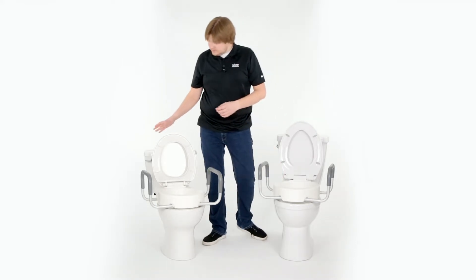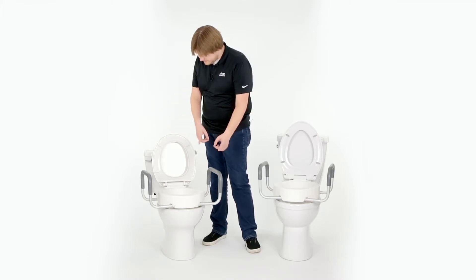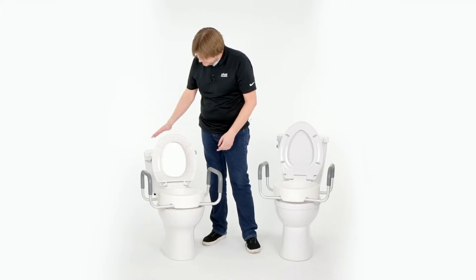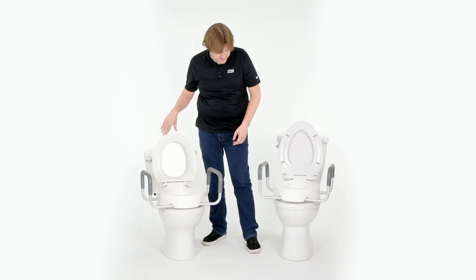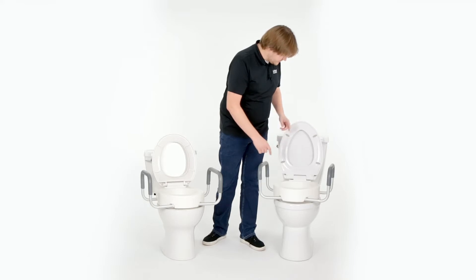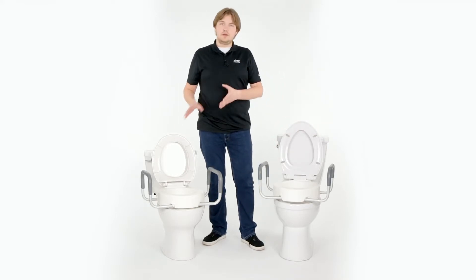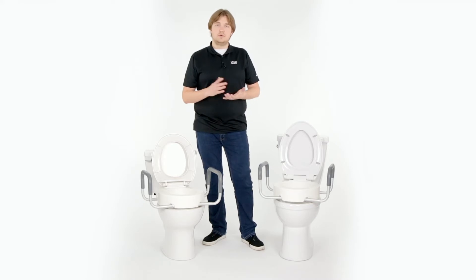As you can see, the standard size toilet is more of a rounded shape. The depth in the bowl isn't as deep — you can see that from the underside of the seat — as opposed to an elongated, which is deeper from front to back, with more of a pointed shape.